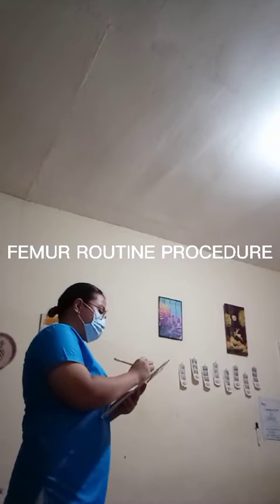Patient number 18. Ma'am, patient number 18. Ay, ma'am. Sige. Palihog lang po, ma'am. Number 18, ma'am, no? Okay. Proceed lang ta sa room 8, ma'am. Ma'am, okay. Instruct ka ha. Kusa pa, ma'am. So, ma'am, makasabot ba kang Bisaya, ma'am, or English? Sa may preference din mo, ma'am, na language? Bisaya o English, ma'am, pwede.